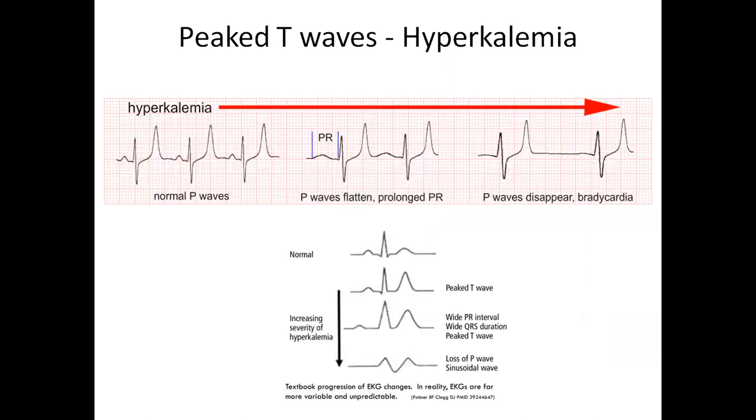This is one thing you really need to know, because if you ignore it, a patient can die. And that is what we call peaked T waves. Okay. That indicates high potassium, or we call it hyperkalemia. Okay.